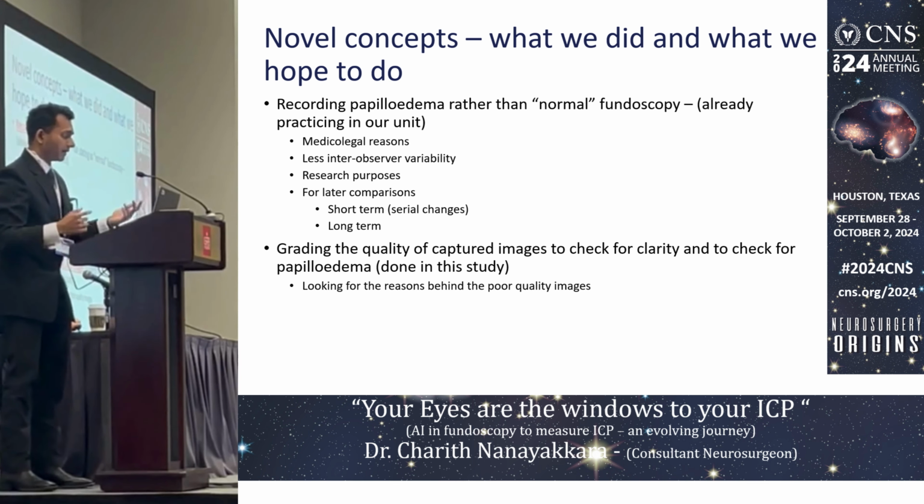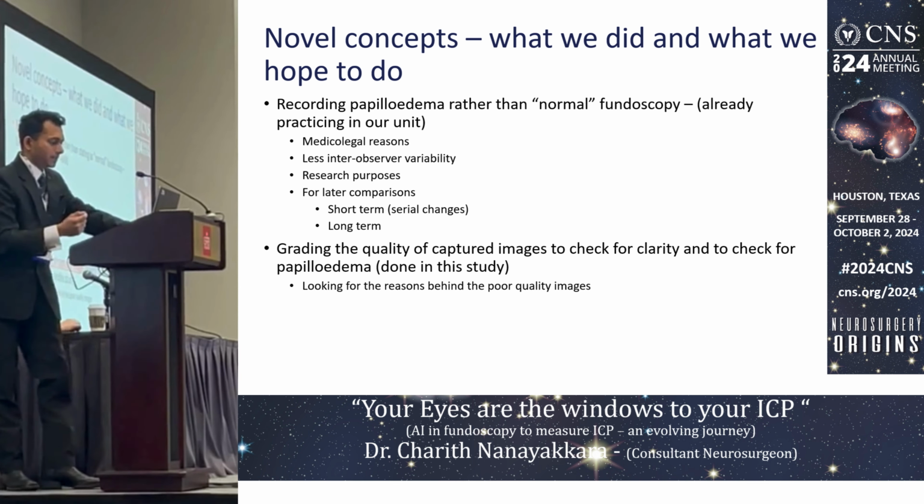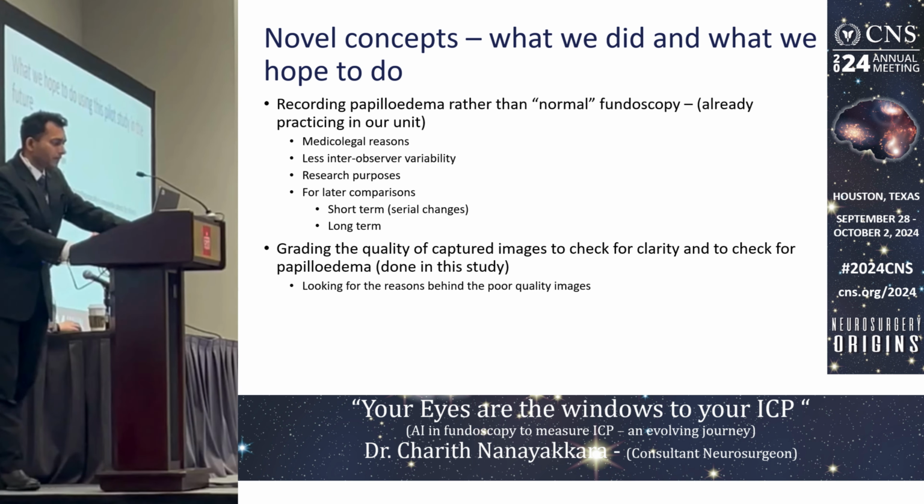Then we graded the quality of captured images to check for clarity and also to check for papilledema, which is what we did in this study. And we also looked for the reasons behind poor quality of some of these images.